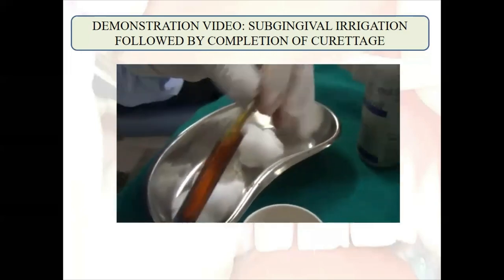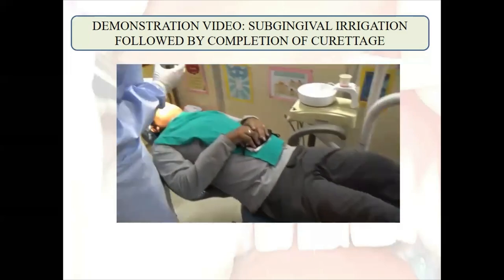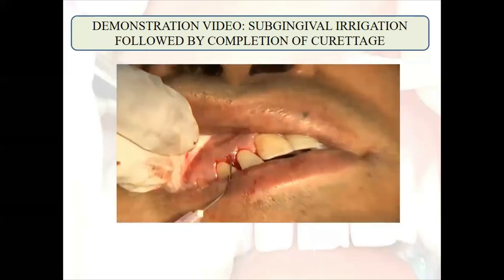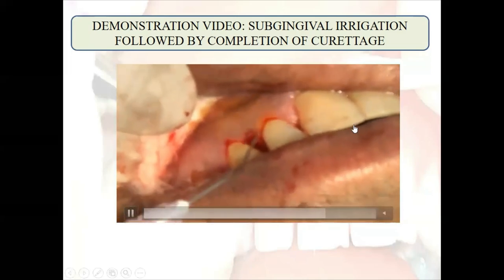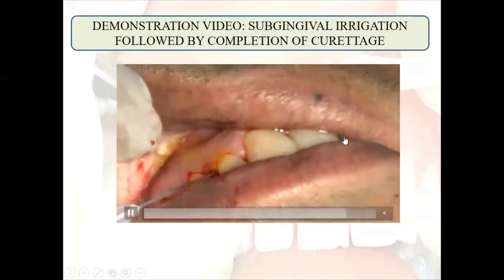As you can see, we do a very nice forceful irrigation in the area where we have done our gingival curettage procedure. And this is basically the completion of the curettage procedure.